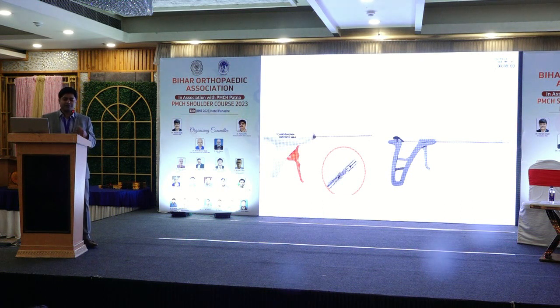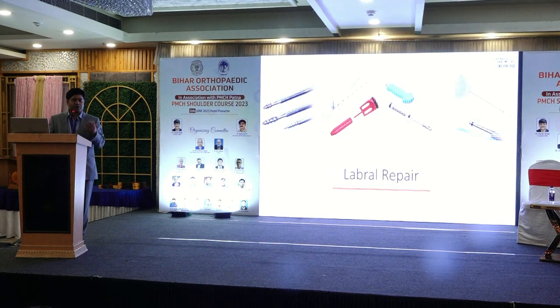And if you can invest a little more, then you can get a multi-fire Scorpion, where you can load all the sutures in the needle at one go and multi-fire and retrieve them with a single pass. So these are advancements to make your life easier, but at least you can have something basic like a First Pass Mini to make your rotator cuff surgery easier. Coming to suture anchors, there are varieties of these in the market. You will have to decide what you want to do.